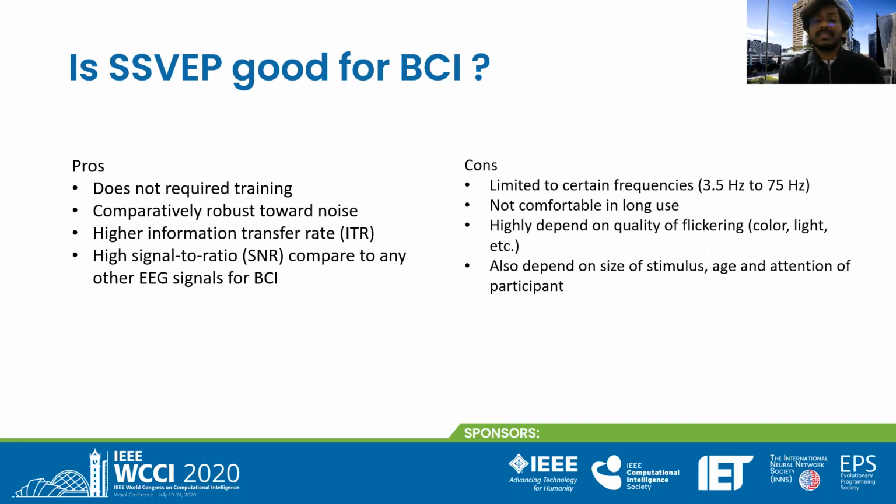It has also been seen that with age, the effect of SSVEP decreases, and more importantly, participants need to pay attention toward the SSVEP to react toward whatever the user wants to do. So if you don't have this kind of consideration while developing an SSVEP-based BCI, the system is promising, but still not promising.